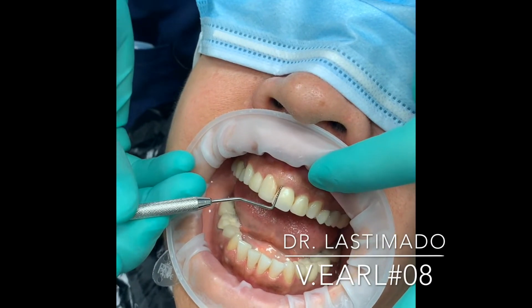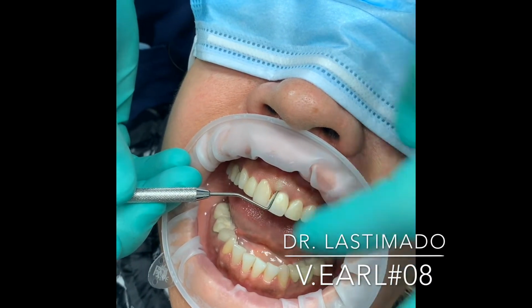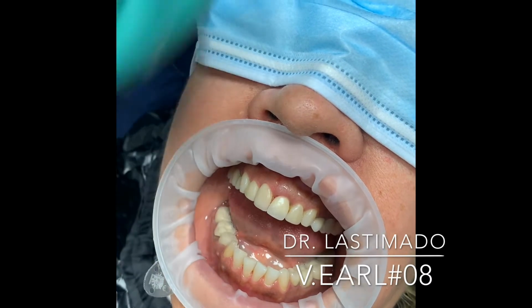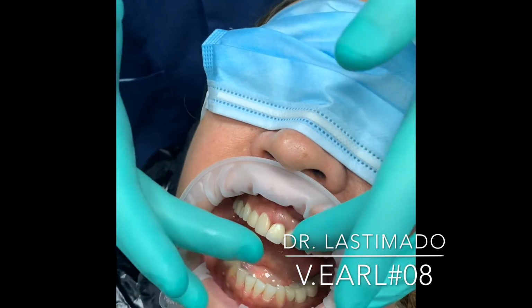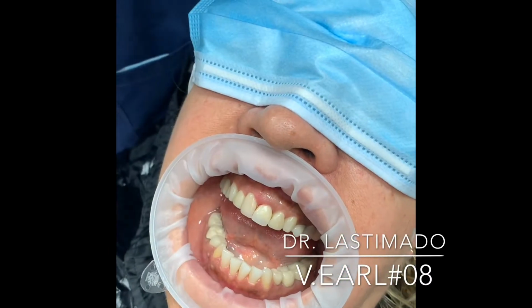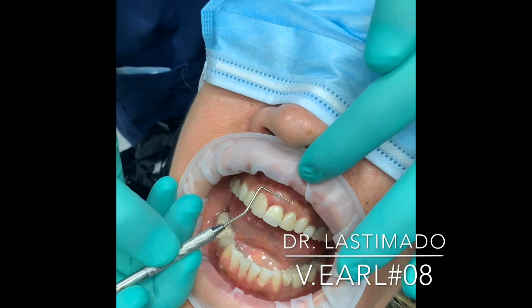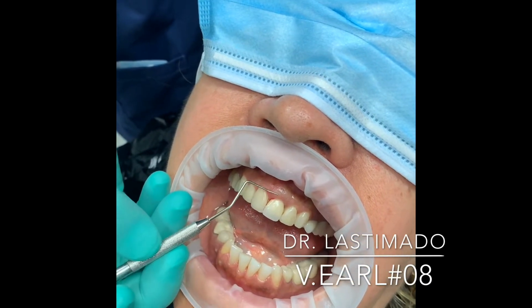As we come in here, when we feel, you can see there's a mesiobuccal root fracture right on the mesiobuccal line angle. But before we proceed to extract the tooth and do an immediate anterior implant, Hyacinth implant, and graft and things of that nature, we need a reference point for that depth placement. You can see the number 8 has a nice height here. We have a good thick gingival biotype, so we have a little bit of room to play with, not too much.